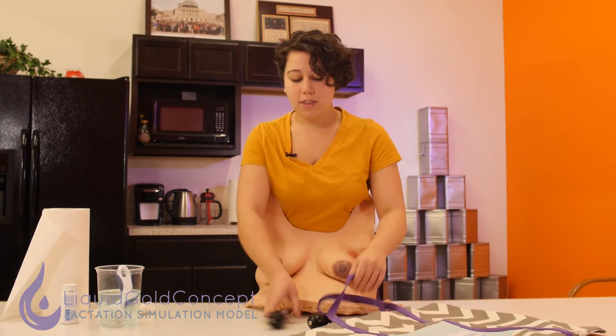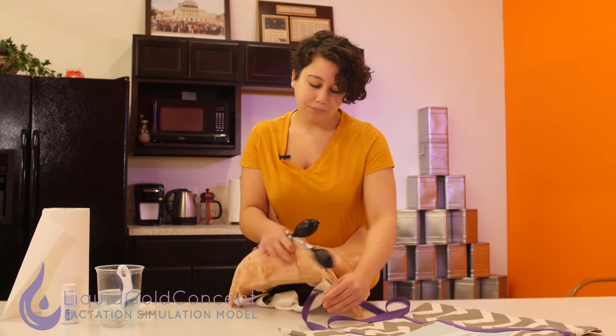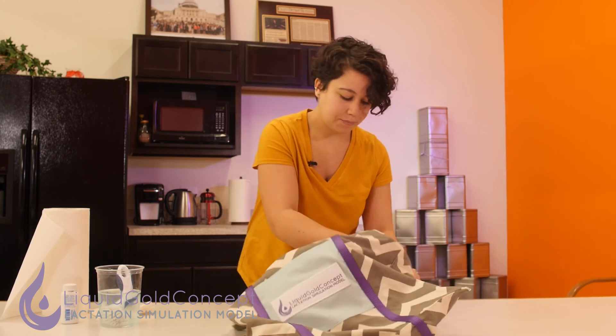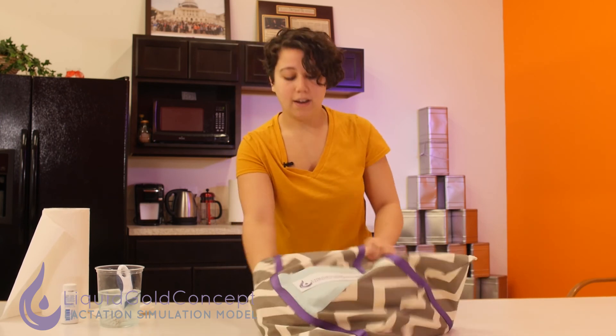The way I like to go about doing this is first slide in the blood pressure bulbs at the bottom. Then go ahead and slide the abdomen into the bag, making sure not to get caught on the breasts. Once that's in, you're going to want to ensure that the straps made it in as well.